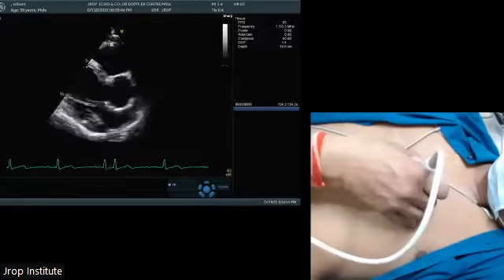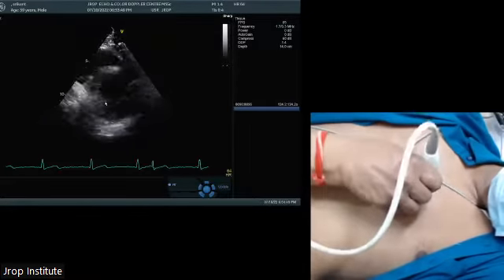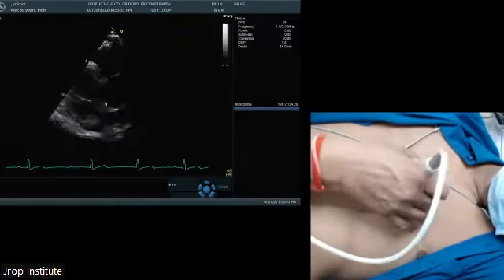Are we clear about the parasternal window? Sir, the last view, please. Can you repeat it?